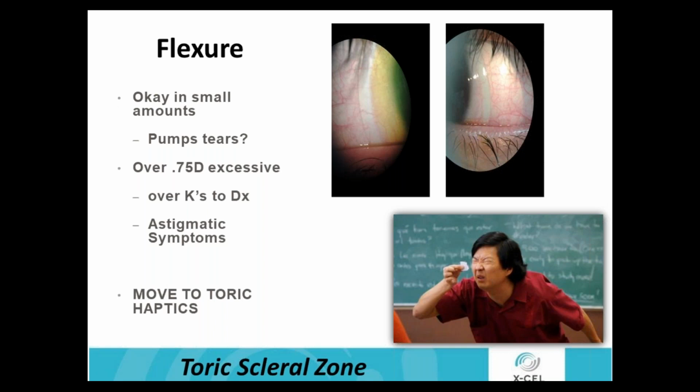Now, going back to the thickness of the lens, again, it's important to know what lens you're working with, what is the thickness in my fit set lenses, and then what is the thickness on my patient lenses. Because from a lab's perspective, when you make a lens, the lens thickness is determined by the power of the lens.